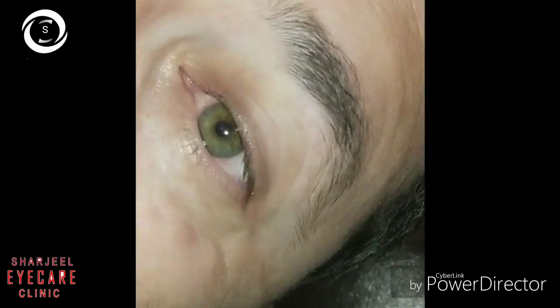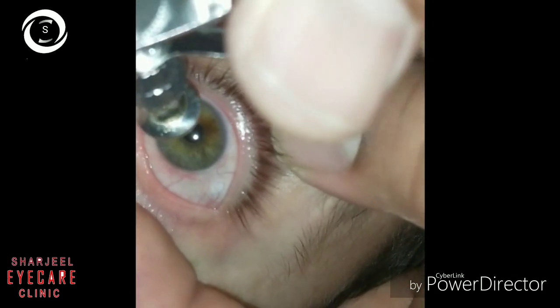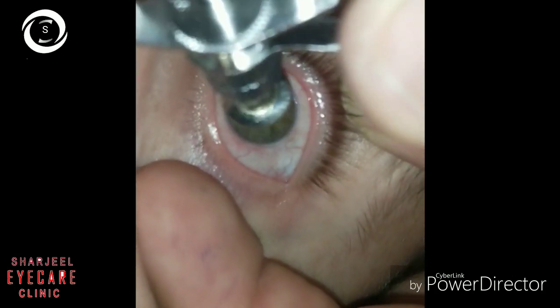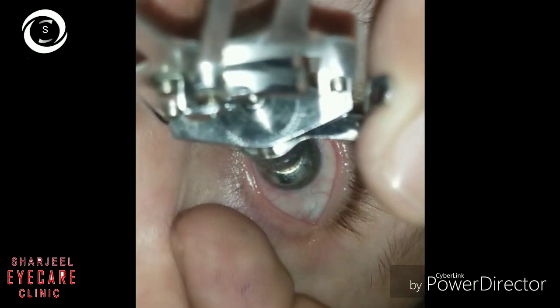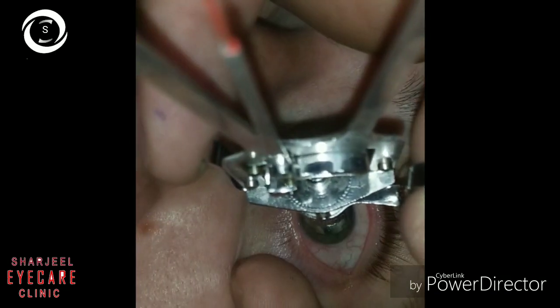You should place the foot plate in the center of the cornea. Here you can see the foot plate — that is how you should place it in the center of the cornea to get accurate readings.